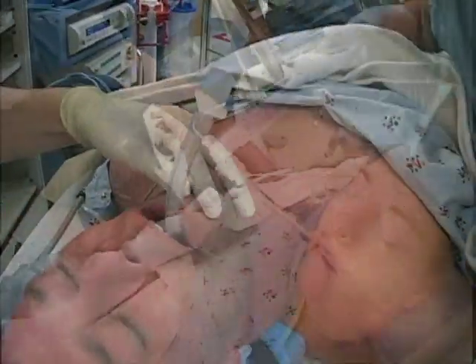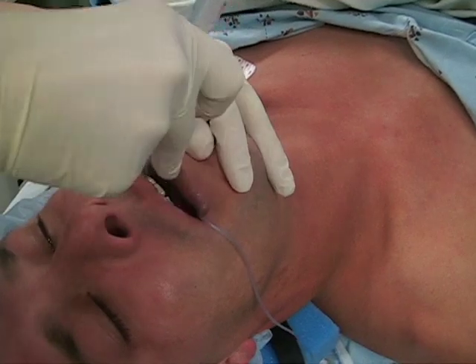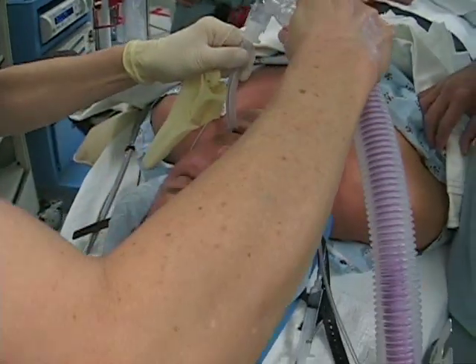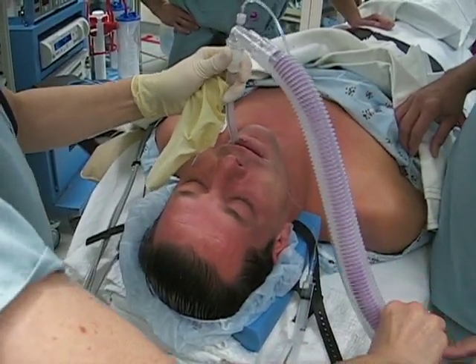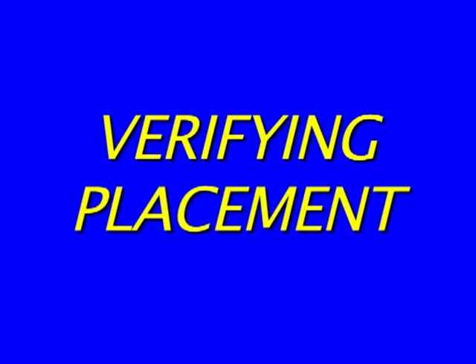Don't let the tube overlie the tongue. If it does, you risk accidental extubation because less tube is inserted into the trachea, despite the fact that the numbers at the lip in this situation inaccurately indicate an adequate depth of insertion.